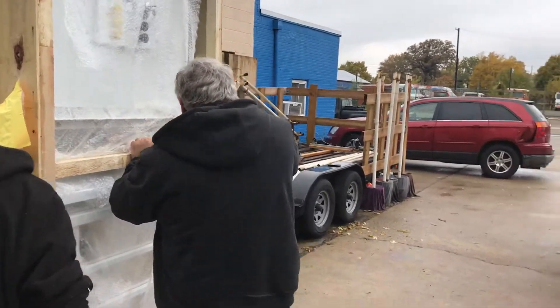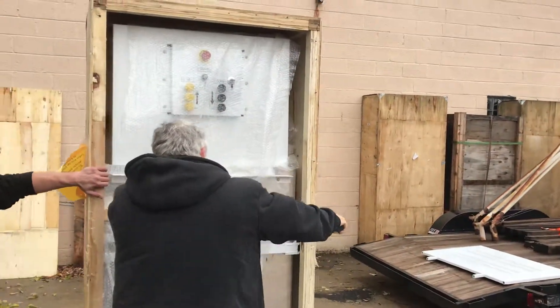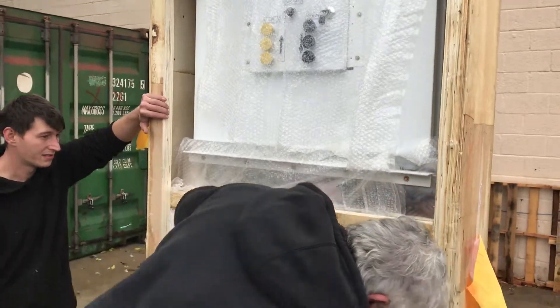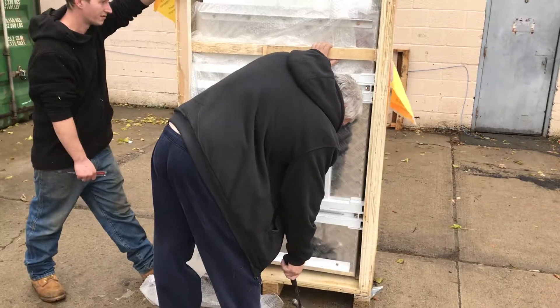This will require more than one able-bodied person. You can see the container itself is very sturdy to prevent damage while the device is being shipped.